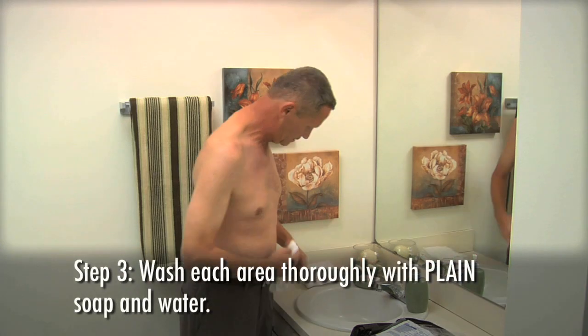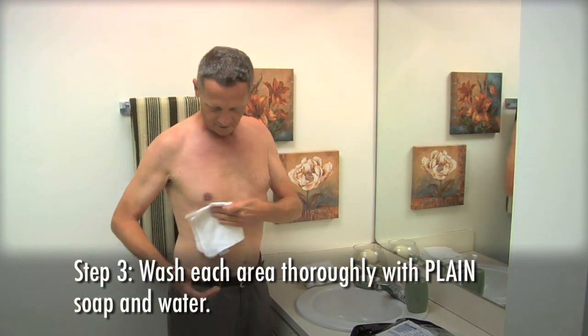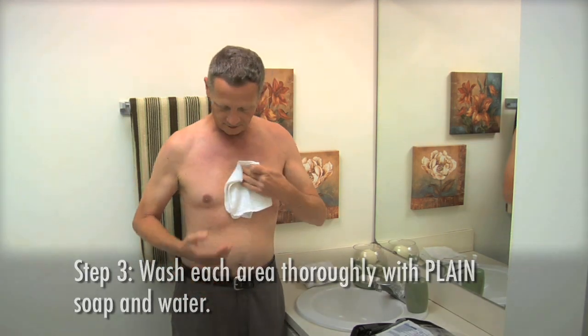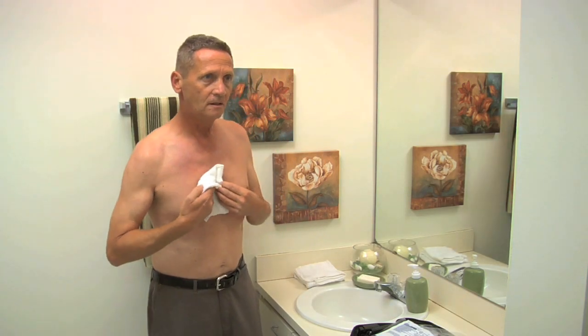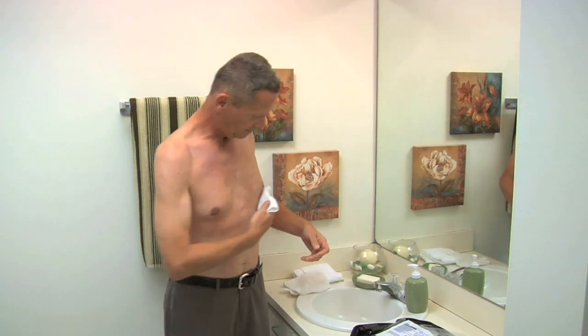Step 3: Wash the area thoroughly with plain soap and water. If possible, try to avoid soap that contains lotion or oil. Step 4: Dry the area well.